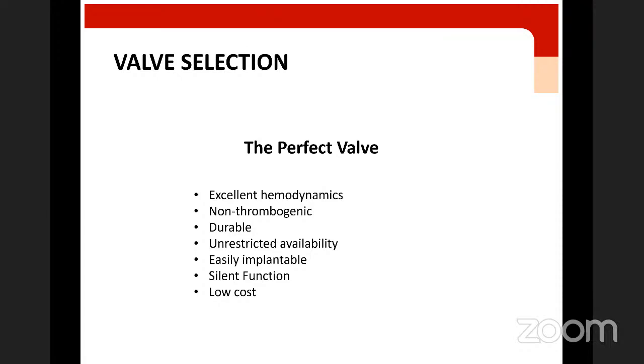What we expect of an ideal valve to be implanted is excellent hemodynamics, so the gradient across the valve when it's inserted is low and it does not regurgitate. We want it non-thrombogenic, so no need for warfarin, or if on warfarin, less risk of thromboembolism. Durability is an important issue: how long does it last as the patient advances in age? Some patients want one valve for life.